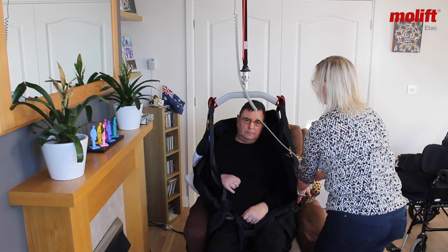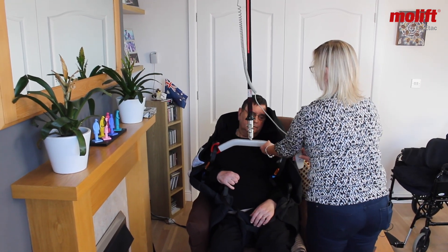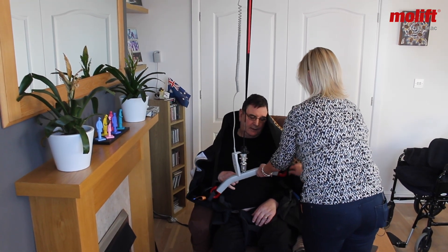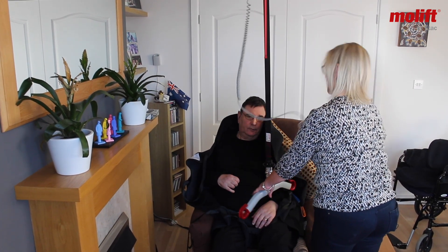Right, how are you sitting? That's good, and it's as easy as that. So he now takes the straps, undoes them, and takes the straps off. I'm sitting comfortably.